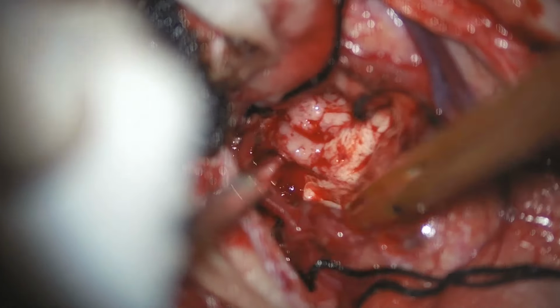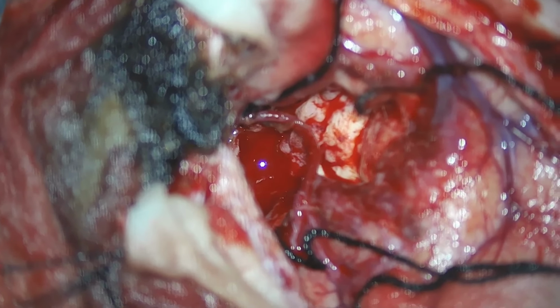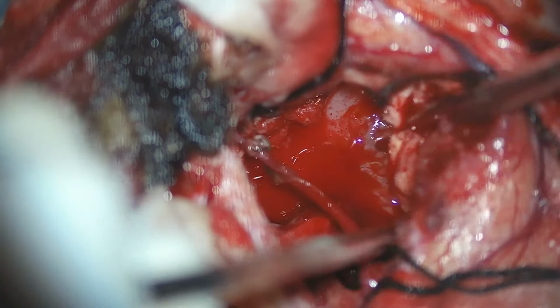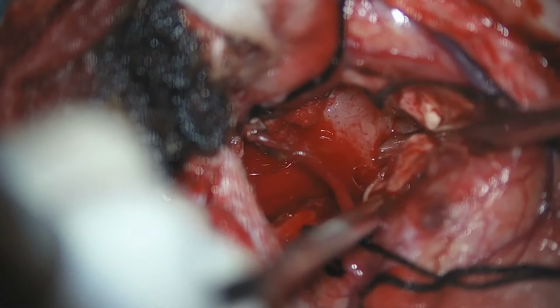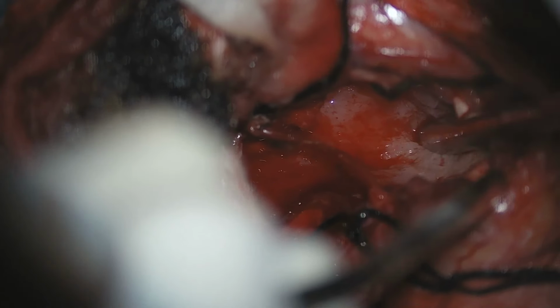So you can see the areas of normal brain and the tumor tissue, and the junction between the normal brain and the tumor tissue is also visible. Again, we try to use the debrider to remove all the dissected out part. So you can clearly see the color difference between the normal brain or edematous brain and the tumor tissue.